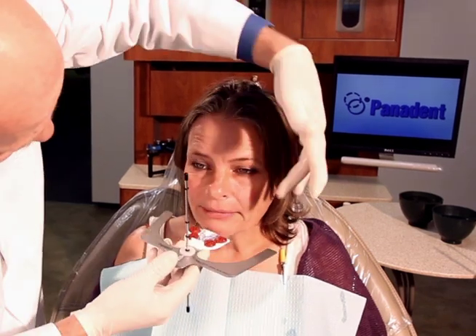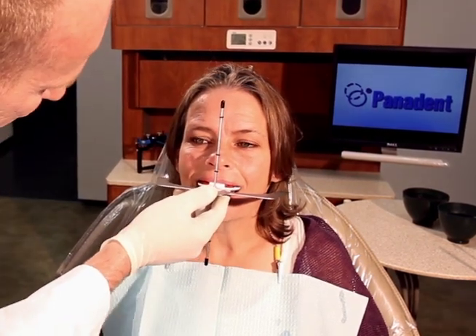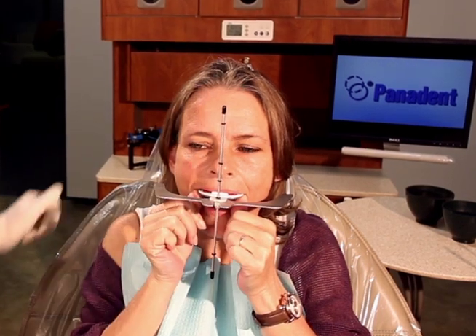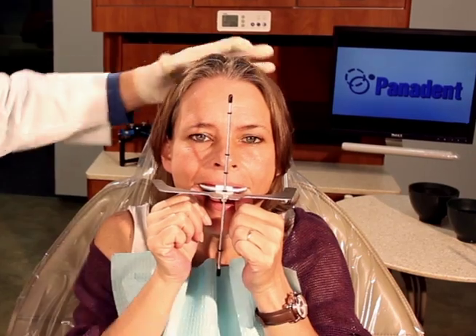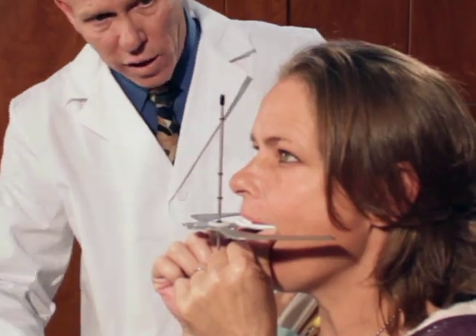The compound has now been hardened with cold water. We can place this back in the patient's mouth to verify that we have a good relationship. I like the patient to reach up with their thumb and put it underneath their teeth to hold this in place, so I can look at it to make sure the vertical rod is down the facial midline and, when she sits erect, that it's approximately horizontal from a profile view as well.